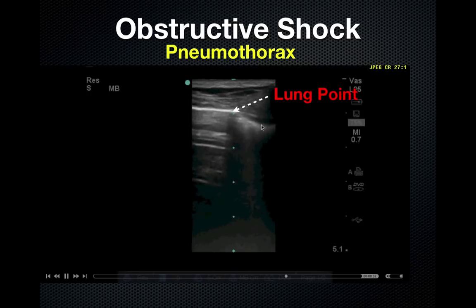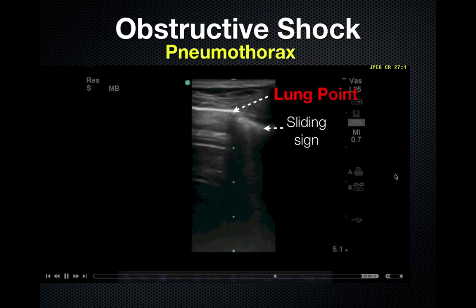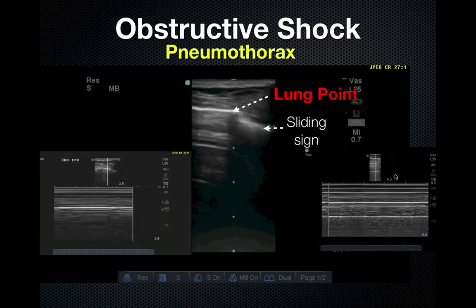Whereas right adjacent to it, in the same pleural space, you can see sliding of the visceral and parietal pleura, and you do not have the A lines. In fact, you have some minor B lines. The only thing that can do that is where the lung drops away from the wall at the point of the pneumothorax. If you were to do M-mode across these two sides, you would have a stratosphere sign, or an old-fashioned barcode sign, on the left, whereas on the right you have the seashore sign, where it looks like waves coming into a sandy beach.